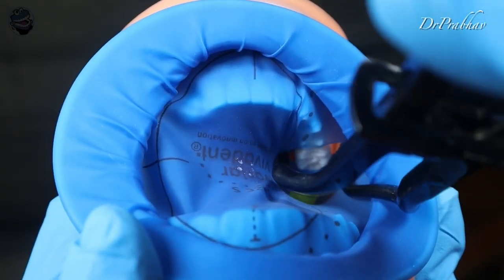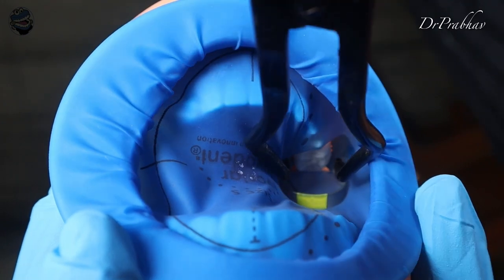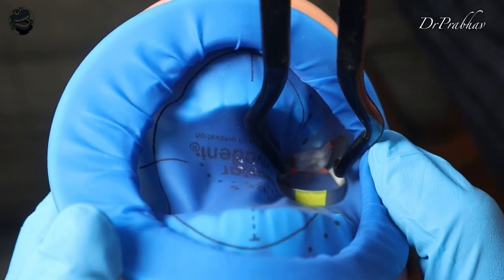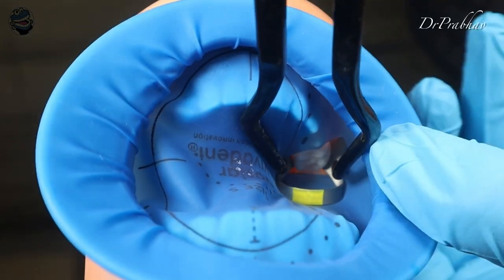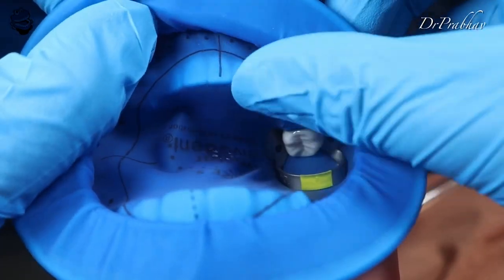This is as easy as it can be seen over here. Once we place it, engage it at a proper place on the cervical aspect of the tooth that we need to engage, we will comfortably remove it. We are done comfortably.